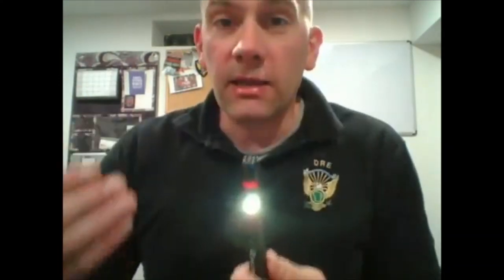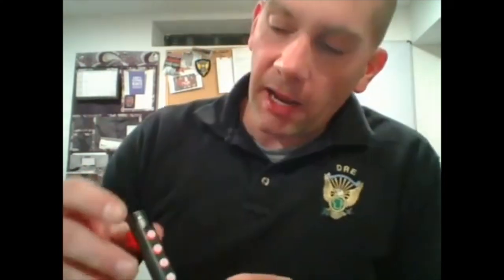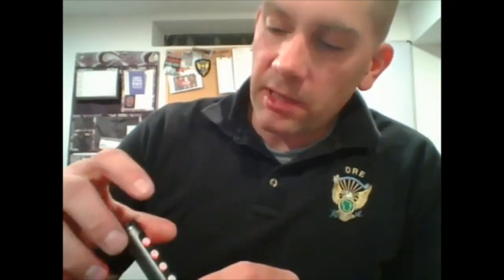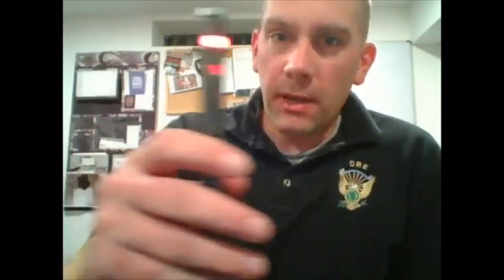Another useful feature, specific for DREs, is it has the five different settings that we use for the HGN test, starting with equal tracking and going all the way to vertical. Here's how it works: you hit the button, it buzzes to let you know to start. When you get out to the side, it buzzes two times. When you go back to the middle, it buzzes again, and so on, until the end, where it buzzes three times to let you know you're done. It's a good review for me, and also for teaching purposes.